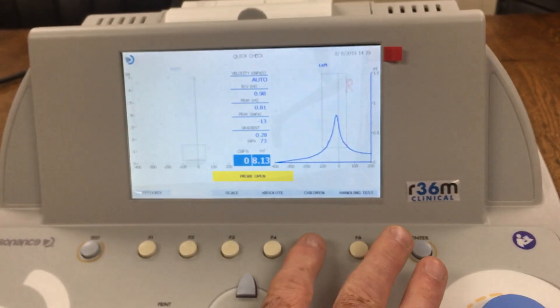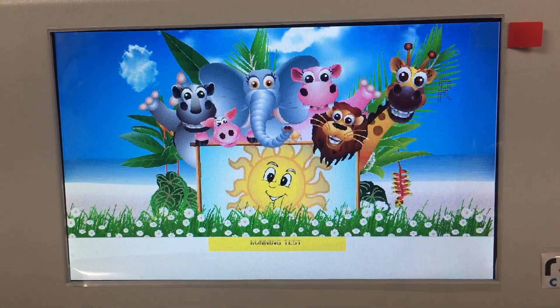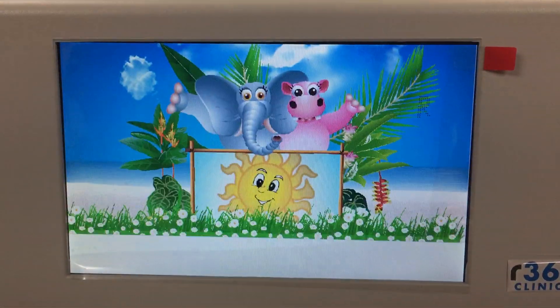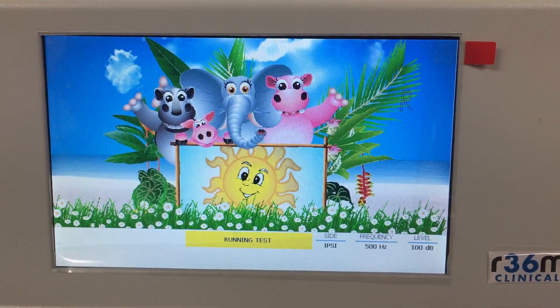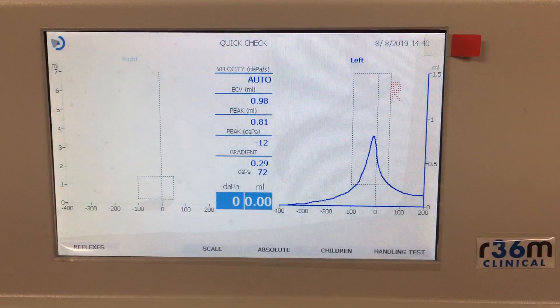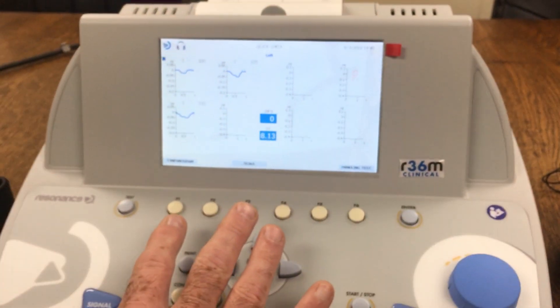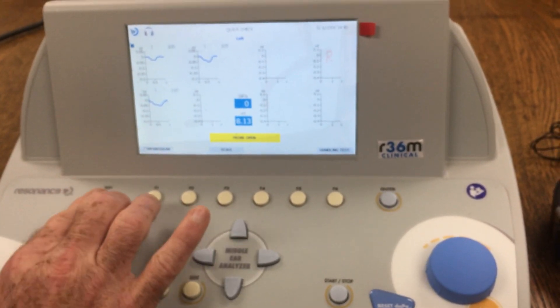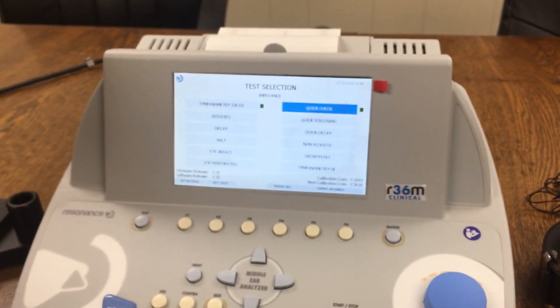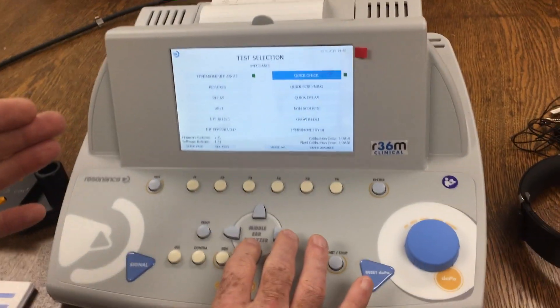If you're doing children's tests, just hit the children's button and do the test. You'll see your children's test results and the reflexes. Keep in mind you'll set the parameters for children differently than for adults. You'll also have the option of connecting the device through the back via a cord to upload results into MDS software. These are all the tests you can go through and use — and if you want to go to the setup page, you can set up your parameters there.